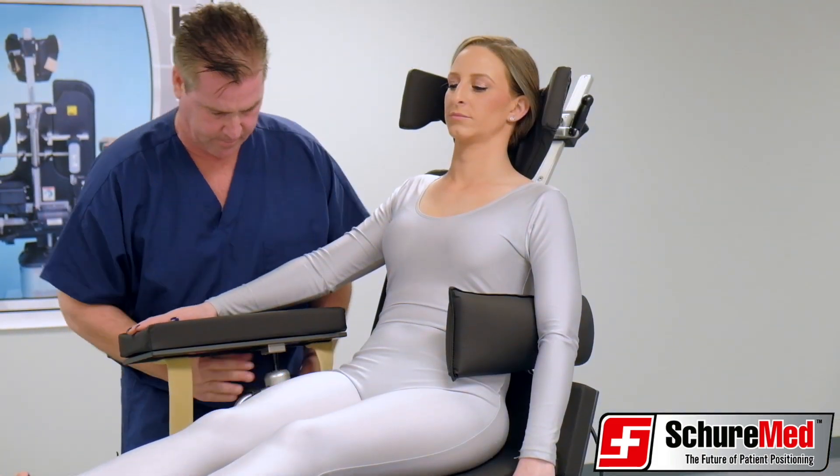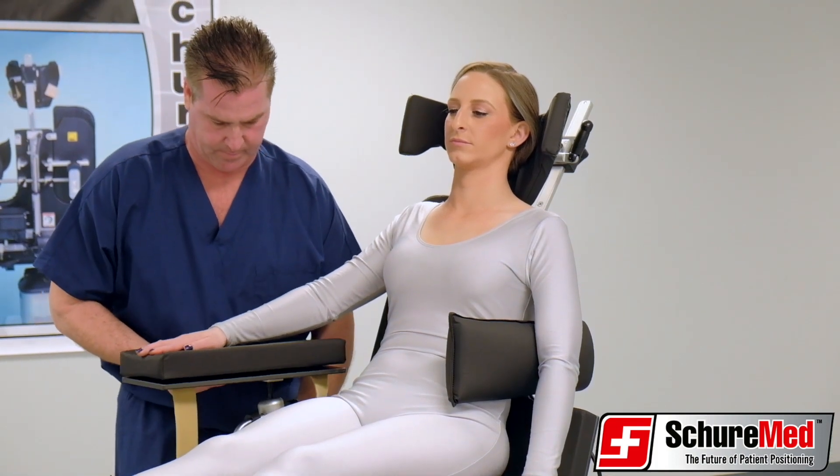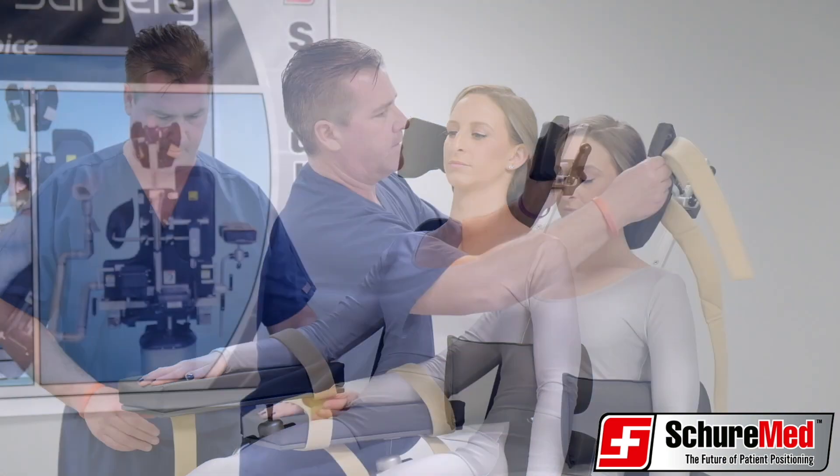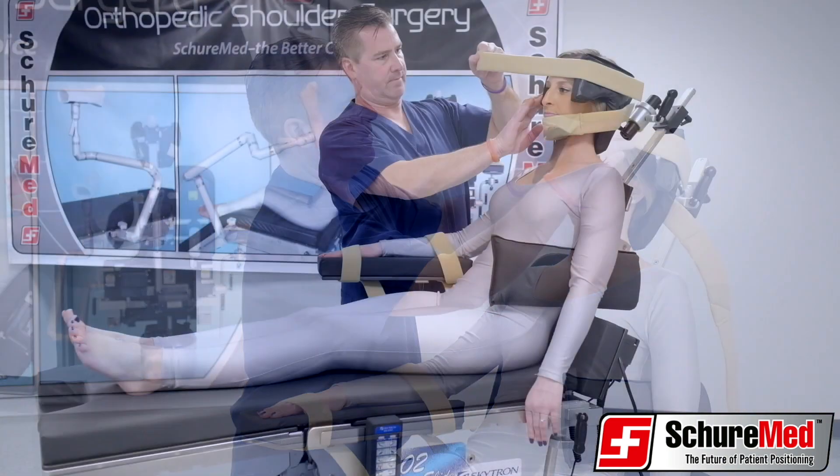Attach the brace for the non-operative hand and secure the arm with Velcro straps. Lock all levers and secure the patient's head in place with the Velcro restraint straps.